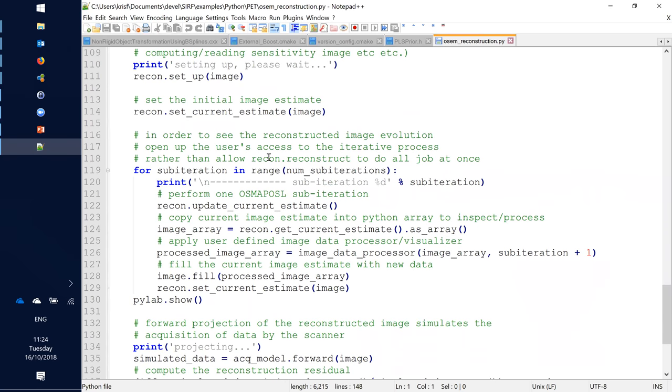And then, as opposed to just calling the reconstructor, in this particular demo it will do one update, so one iteration, which is what Richard was asking, if we would be able to do that for you as well. And then we get the current estimate out and do some filtering and whatever. All of that really isn't STIR or anything like that. What's good here is that if you do only one update, then you keep everything in memory, everything already allocated, so you can call it again.